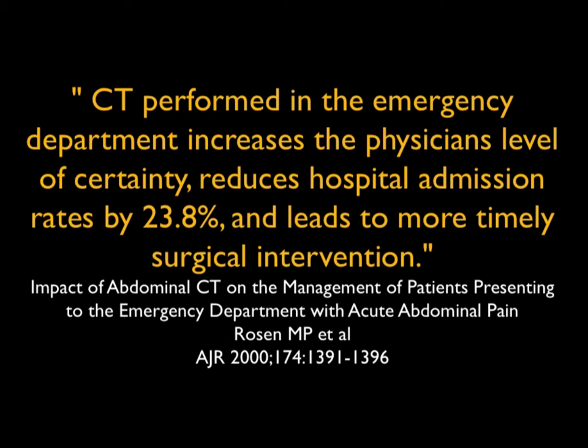Now, there's another study by Jim Thrall and his team. They were really looking at that to see how CT affects physician decision-making in the setting of non-traumatic acute abdomen. Well, their numbers were impressive.